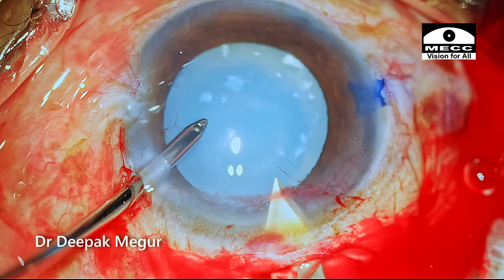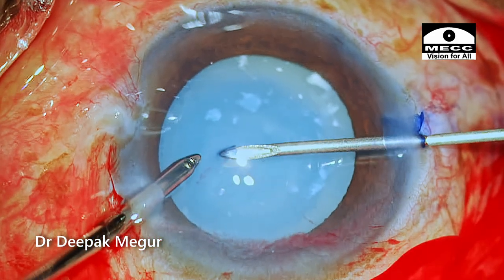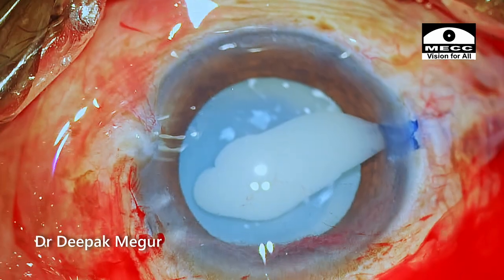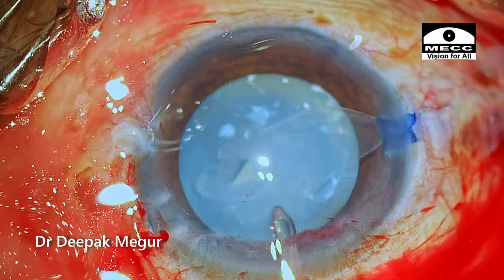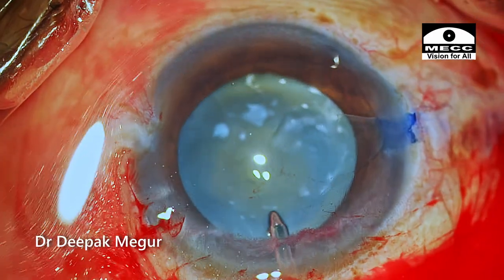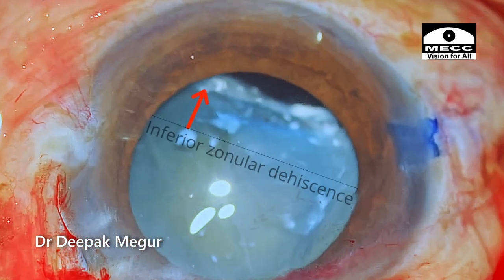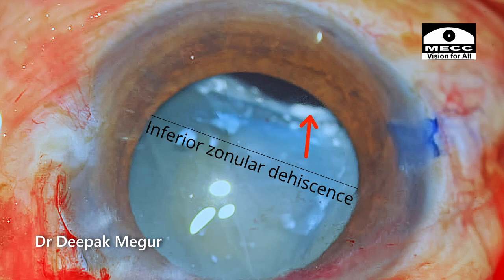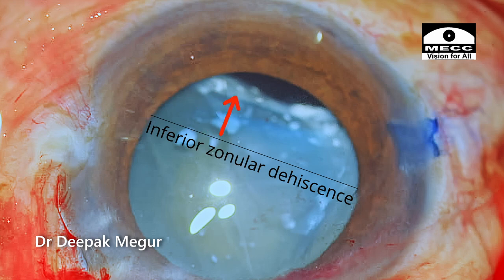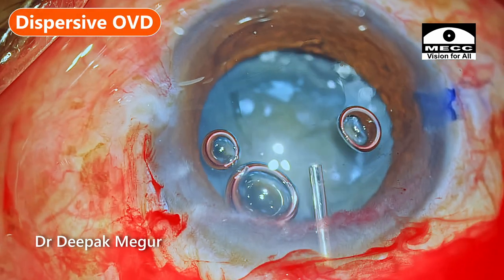The scleral tunnel entry is done and now is the time to perform the capsulotomy. As expected, once I puncture, there is aggressive liquid cortex here. To improve visualization I'm doing gentle irrigation to ensure the fluid comes out, and suddenly I can see that the inferior bag just folds up, suggesting there is a localized area of zonular weakness and probably vitreous would be trying to come out there.